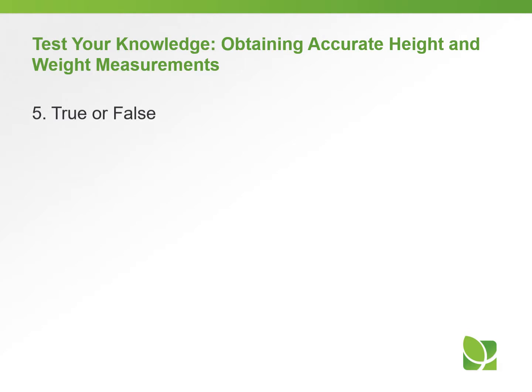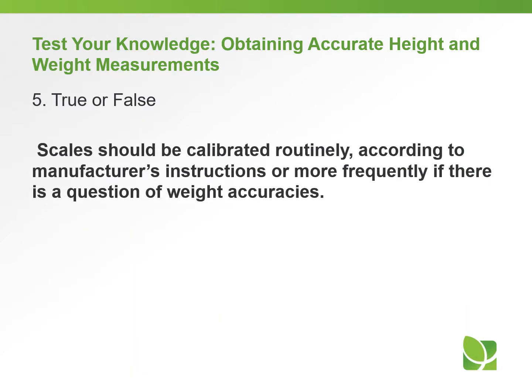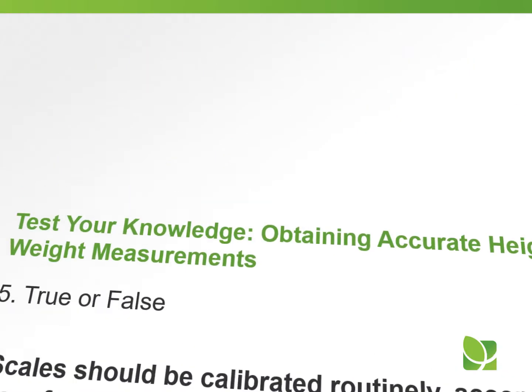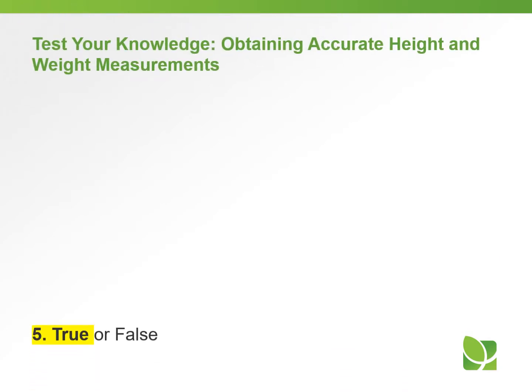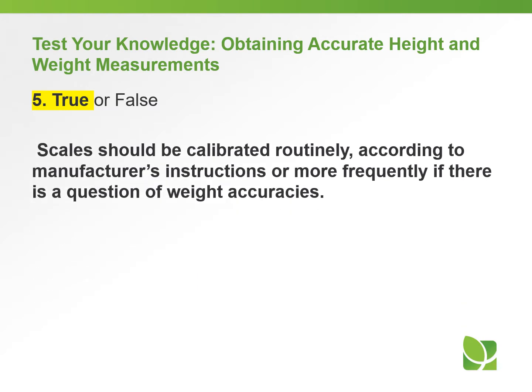Question number 5, also true or false? Scales should be calibrated routinely according to manufacturer's instructions, or more frequently if there is a question of weight accuracies. And the answer to question number 5 is true. Scales should be calibrated routinely according to manufacturer's instructions.